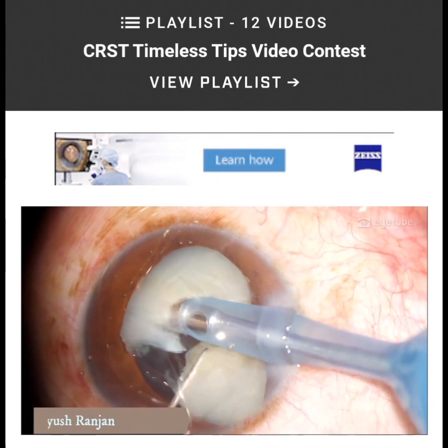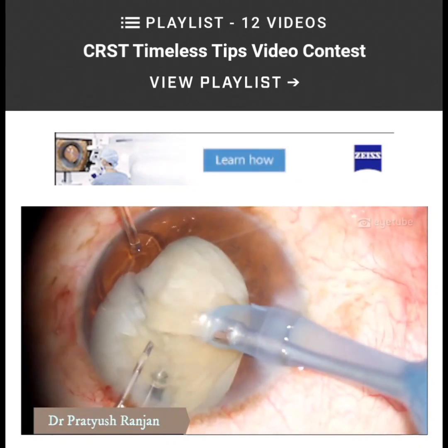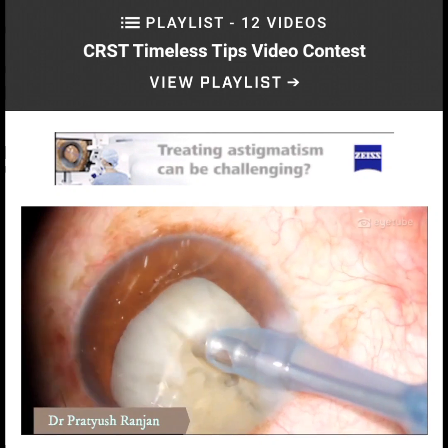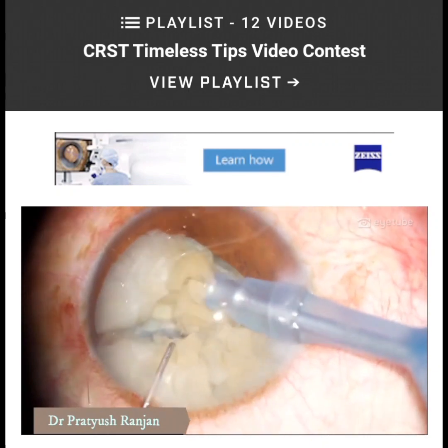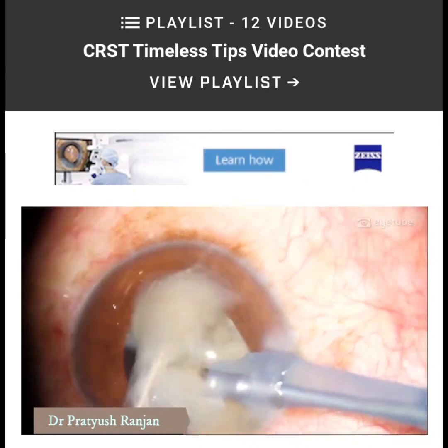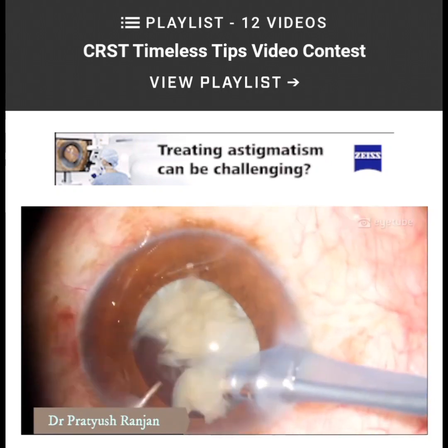You try to pull the nucleus up, and from the equator you give a horizontal chop under vision, so that you're not disturbing the capsule. You rotate and do multiple horizontal chops so that you sculpt the nucleus into various small manageable pieces, and then you push them into the bag again to start the emulsification process, which ideally should take place in the bag. Sometimes it's not possible because the pieces are big and they don't go easily.